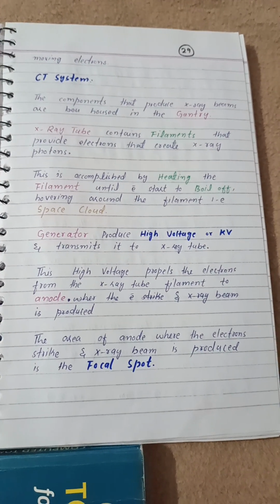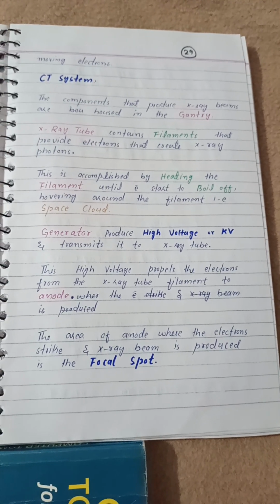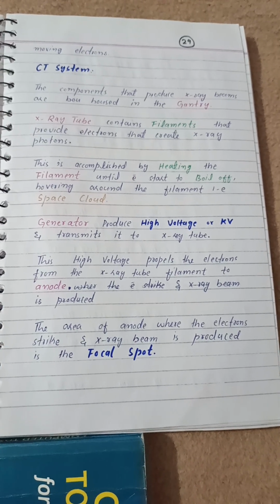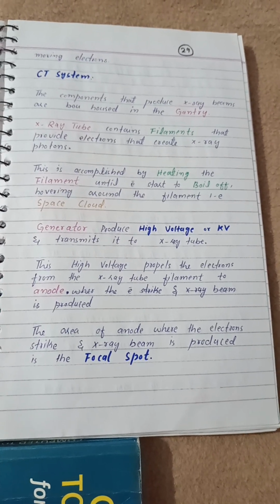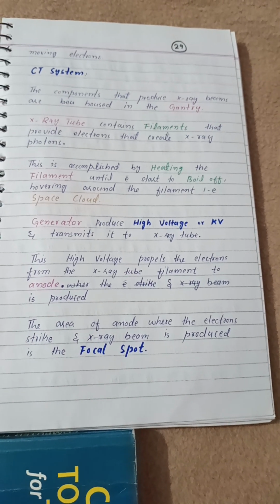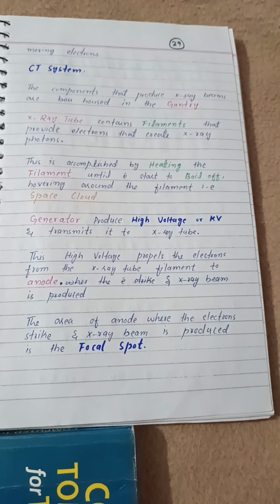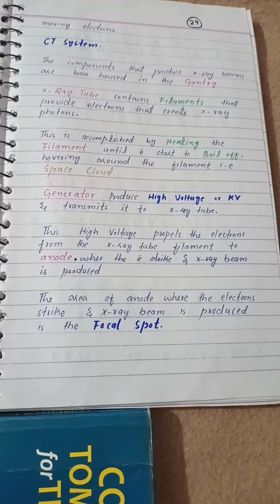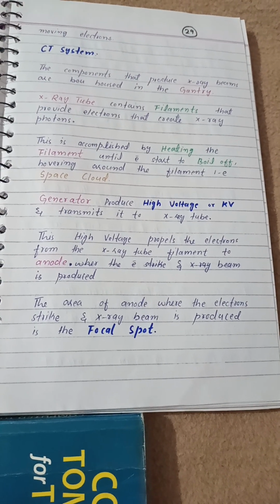This is accomplished by heating the filament until electrons start to boil off, hovering around the filament in a space cloud. The generator produces high voltage, or kV, and transmits it to the X-ray tube. This high voltage propels the electrons from the X-ray tube filament to the anode. The area of the anode where the electrons strike and the X-ray beam is produced is the focal spot.